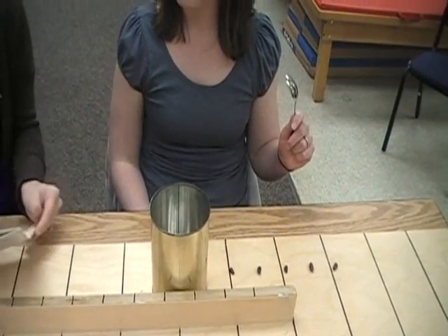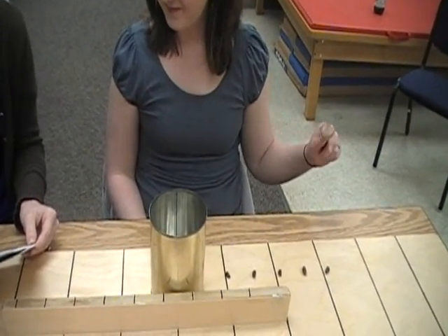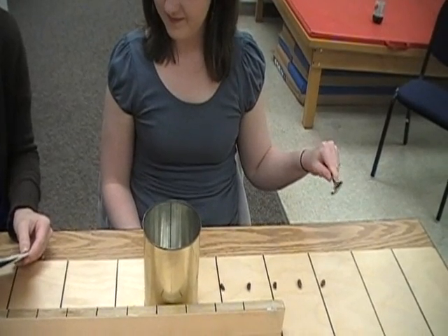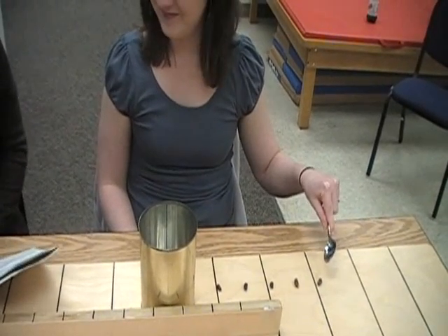When I say go, use your left hand to pick up these beans one at a time with the teaspoon and place them in the can as fast as you can, beginning with this bean. Do you understand? Ready? Go.